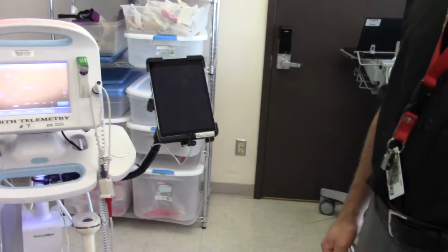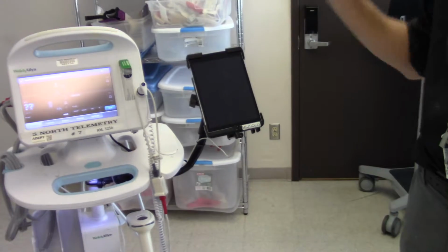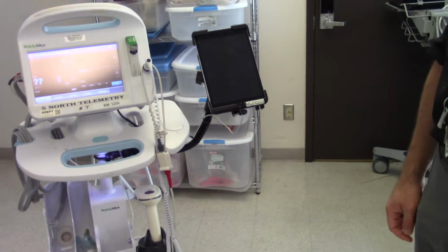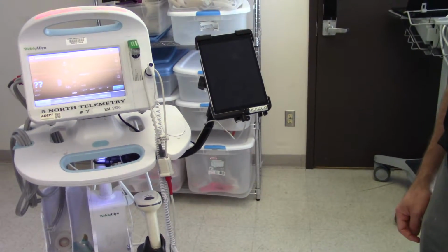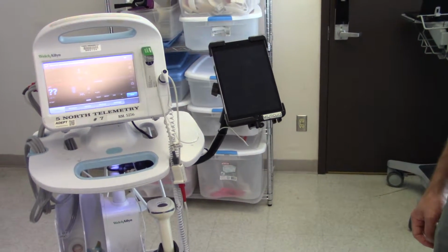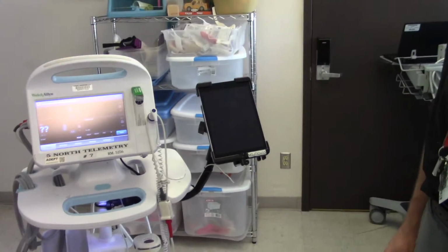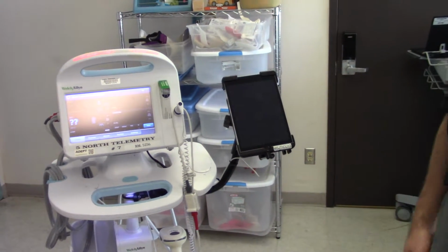Correct. Okay, and so they've kind of given us a waiver or variance for the pilot? Yeah, because with phase two, they figured maybe these will be going, but now we're moving forward and still doing more of a mixed solution, so it's something we have to retouch on. And do you use non-Honeywell scanners for anything else in the hospital? No, not as of now. There may be a few legacy devices that use an older scanner, but nothing currently supported, and nothing that's wireless. We used a Motorola scanner for a little while in our essential supply, but that's not dealing with patient data and information. Since then they've all been replaced with the standard Honeywell scanners.